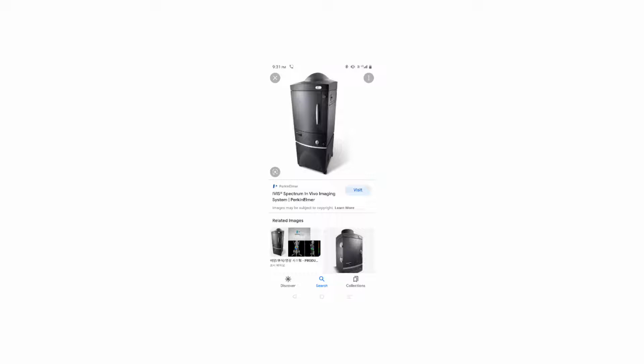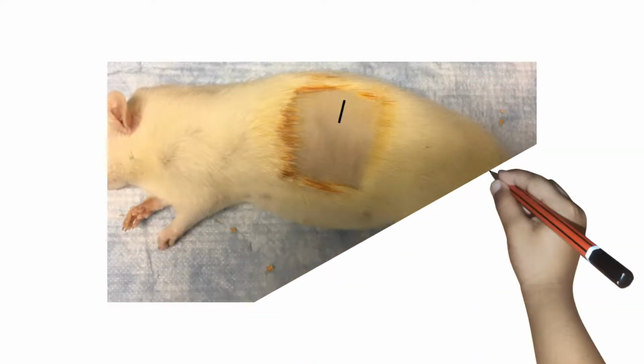There is not much in the instrument; you just need to keep the animal in it, but you need to choose the background where you are keeping the animal, like a white sheet or particular sheets will be provided, and the rest of the job will be performed by the software, where what you need to measure and how the settings are, you just need to know, and the operator will guide you on the initial days when you perform.